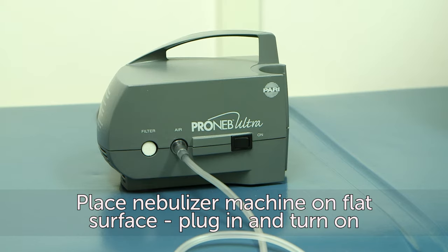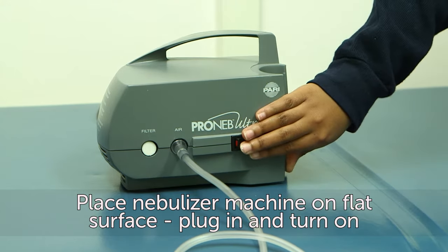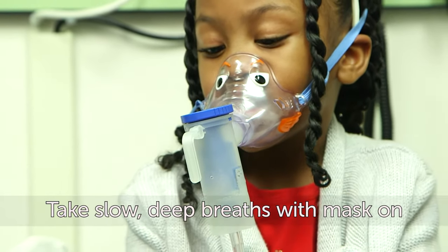Make sure the nebulizer machine is placed on a flat, steady surface and plugged into an outlet. Turn on the machine and take slow, deep breaths with the mask on.